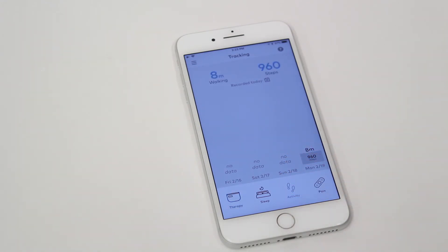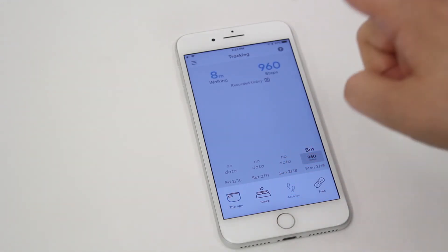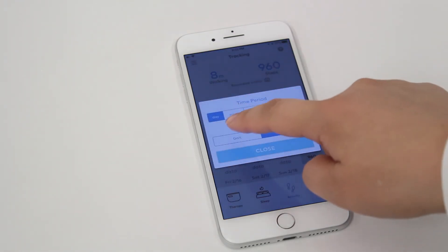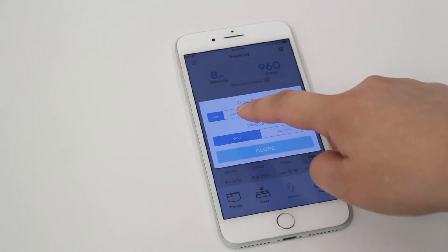the display defaults to activity tracking. To track gait, select the calendar icon and gait to switch the display.